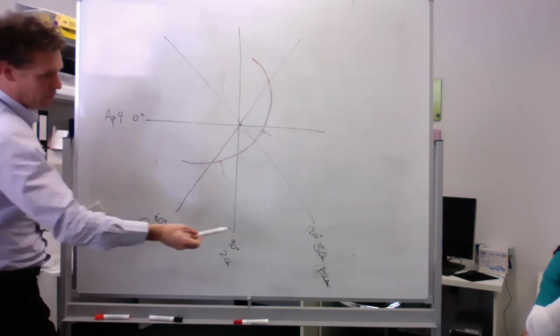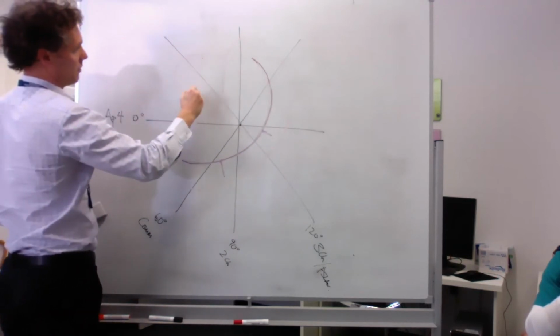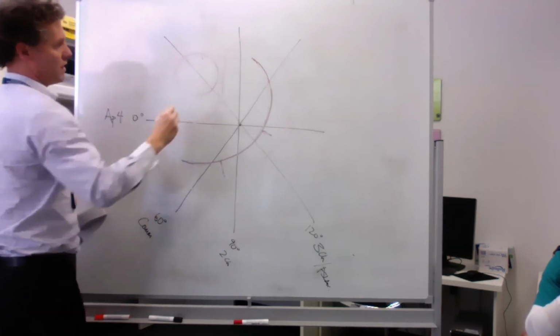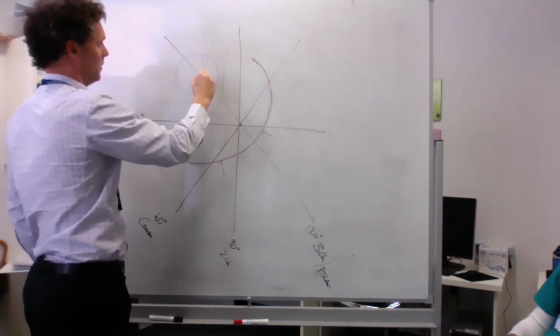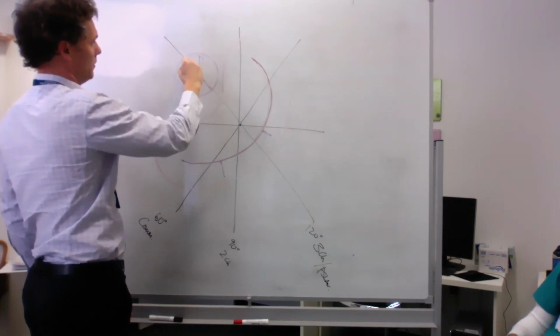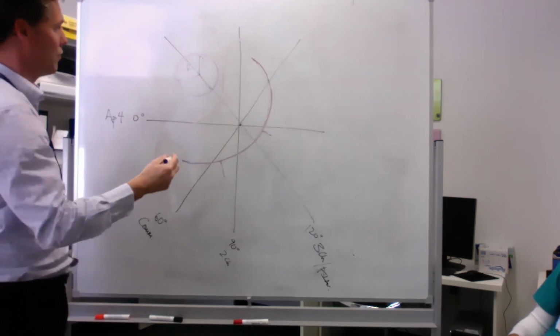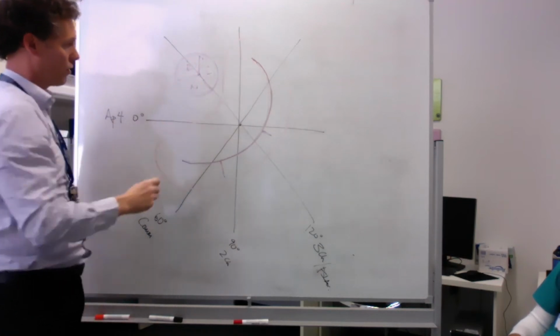The next one I'll remember is that at 120, I'm obviously going through the aortic valve, and you're always looking at the right coronary, left, and non-coronary in the aortic valve.